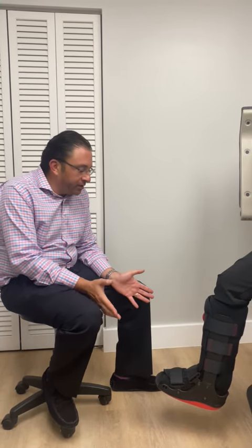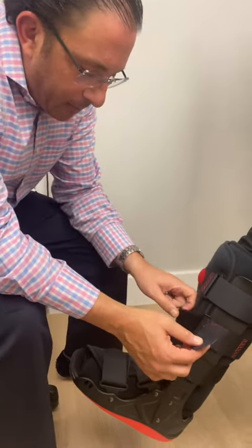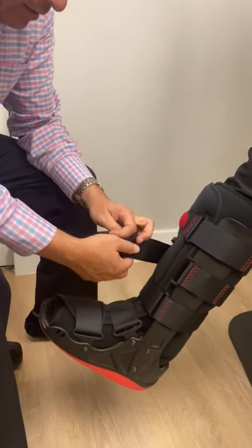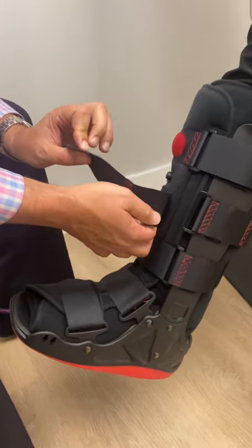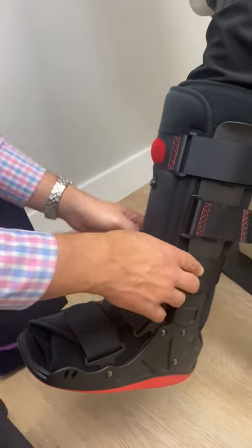The first step, as I like to say, is keep the straps organized. The more you have your straps all over the place, the more difficult it's going to be to put it back correctly. So what you can do is go like that — take it off, reattach the Velcro portion back to the other side, the sticky portion, so it's out of the way.